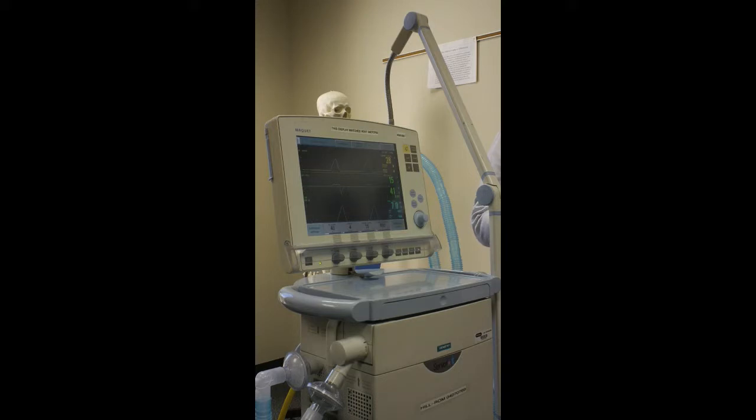Generally, we talked about having set parameters, patient parameters, alarms, and waveforms. Guess what you're going to have on a vent check? Not waveforms, but set parameters, patient parameters, and alarms. So that's the reason why I said what I did.